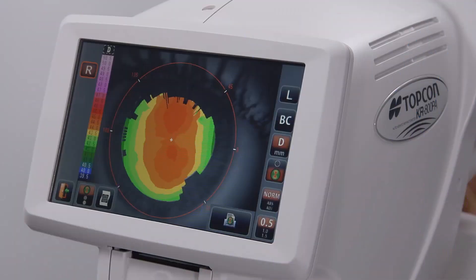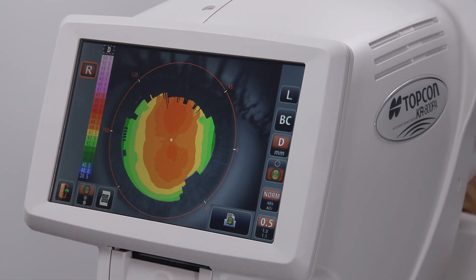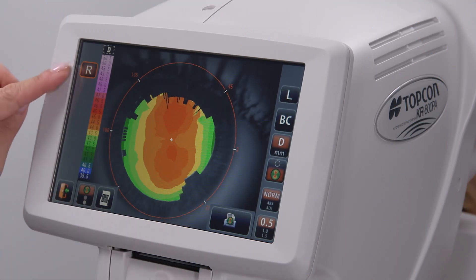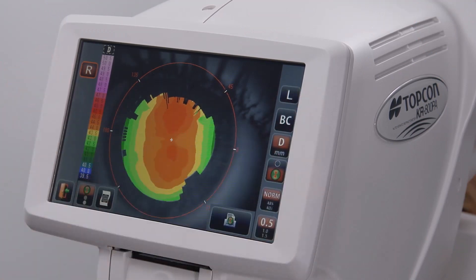If the corneal mapping icon was activated, after testing both eyes, the corneal map screen will appear. Selecting R or L at the upper left or upper right corner will change which eye is being viewed.